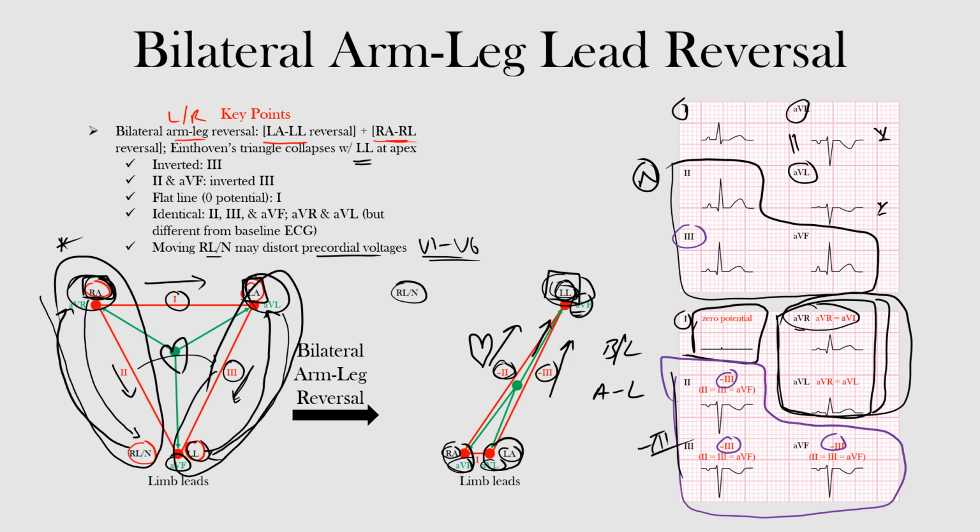Well, that's the end of this lecture. We discussed bilateral arm leg lead reversal and how to identify it on the EKG.